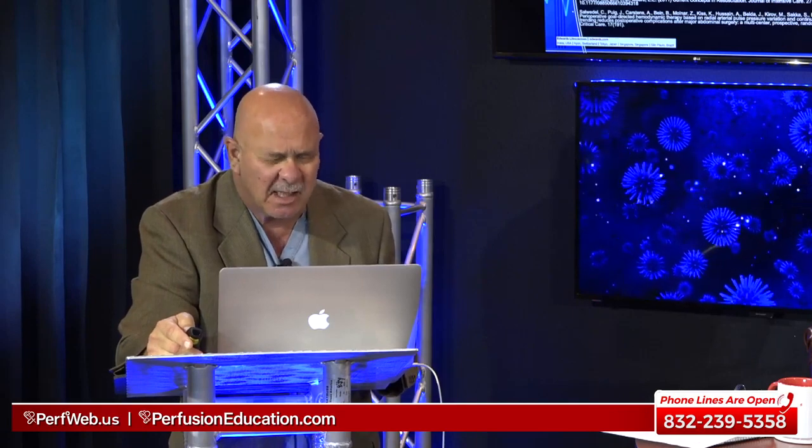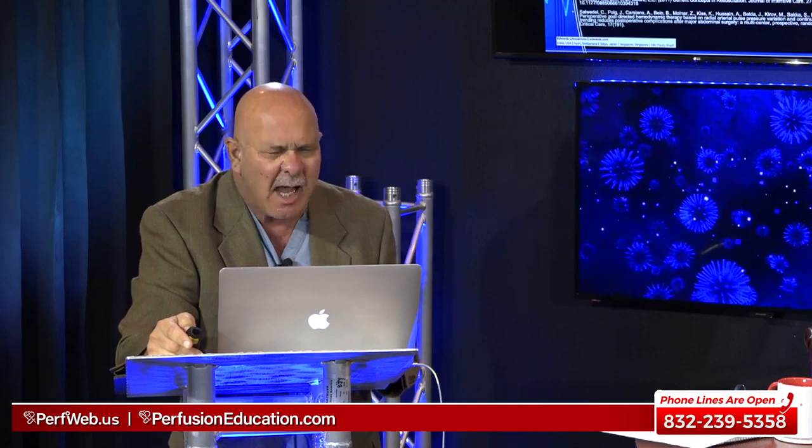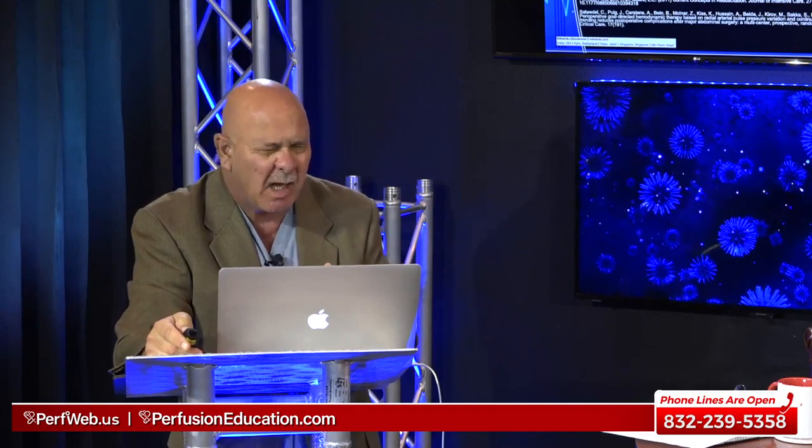I think so. I do think so. As long as you're ventilating at 8 milliliters per kilogram, and I think that's going to be important, and as long as you have a set rate and you have good access for your blood pressure, this device will measure your cardiac output.